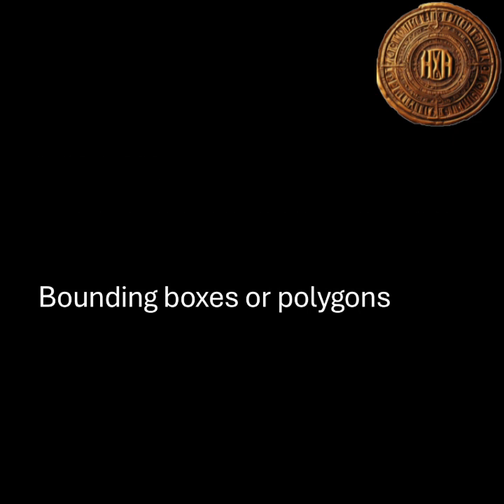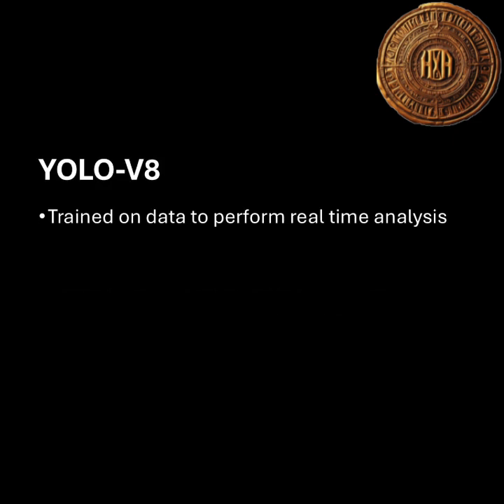And what about YOLO V8? How does it utilize the annotated data? YOLO V8 is trained on the meticulously annotated surgical data to perform real-time object detection and analysis. It's incredibly fast and accurate, making it ideal for applications in the operating room, such as tracking surgical tools, monitoring procedures, detecting anomalies, and enhancing robotic surgery.